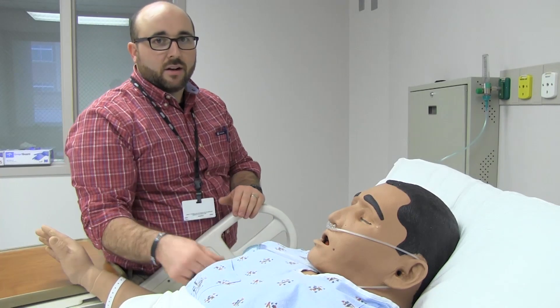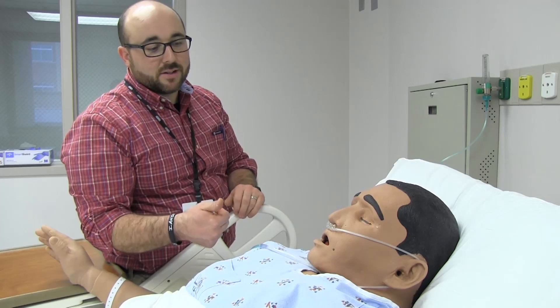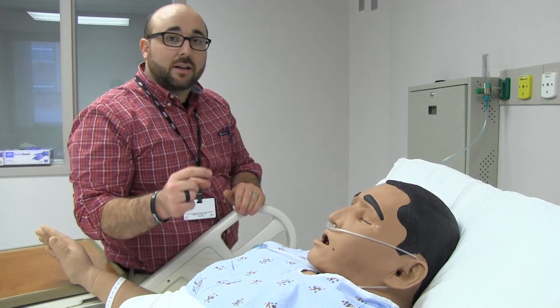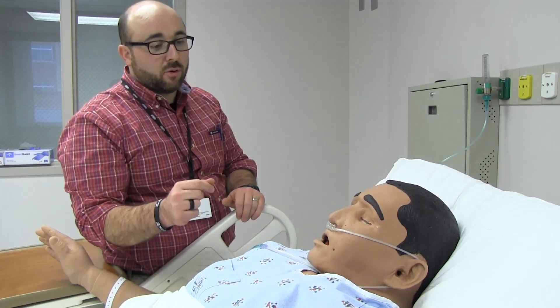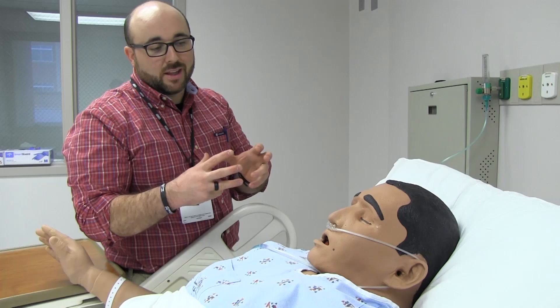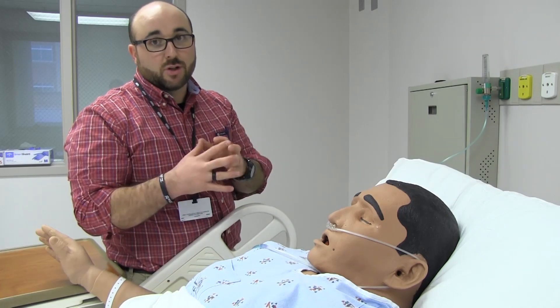This is standard nasal cannula review — one to six liters. If the patient is on greater than 3 liters, we recommend a humidifier, or what we call a bubbler. That just helps humidify the air so it doesn't dry out their nasal mucosa.